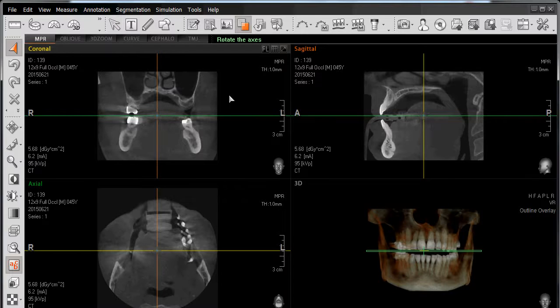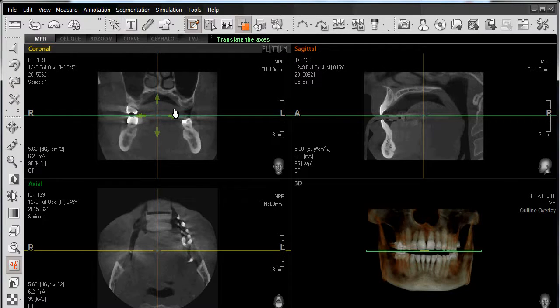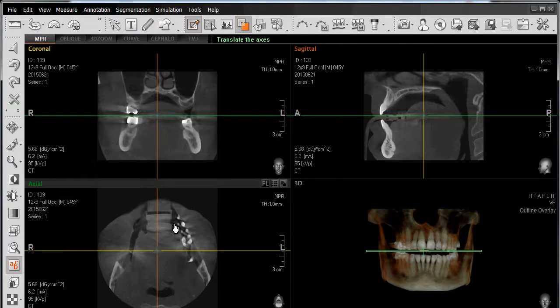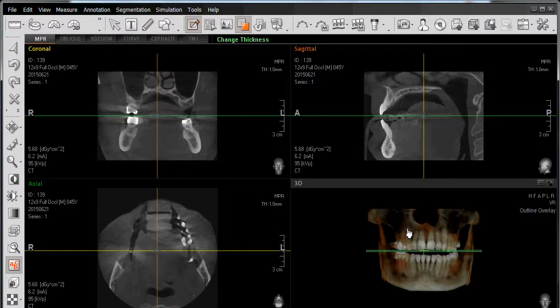To access the sculpting tool, highlight and left click on the icon that says Sculpt. From here we can sculpt either the coronal view, axial, sagittal, or our 3D rendering.